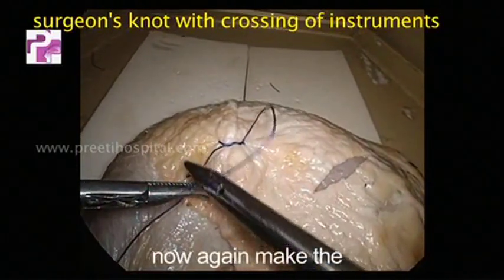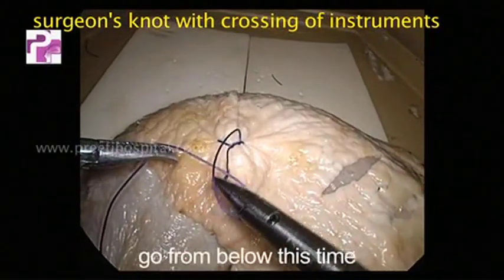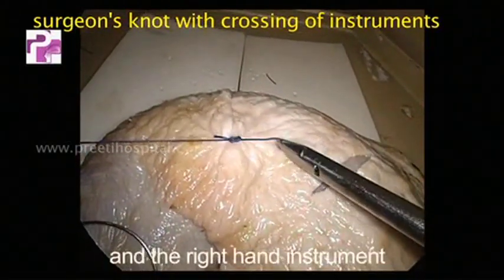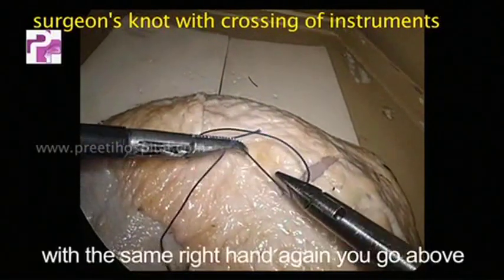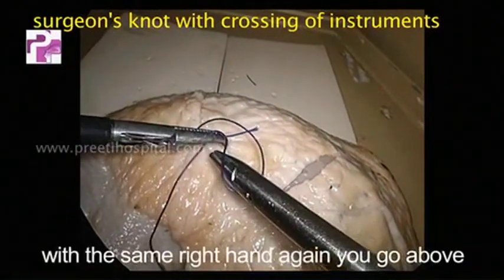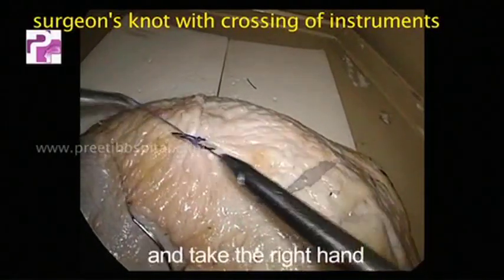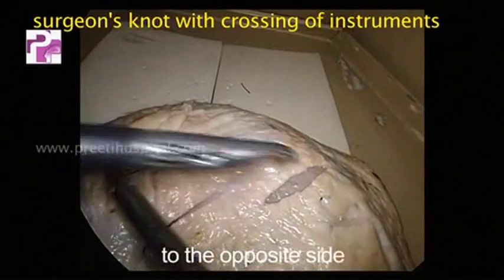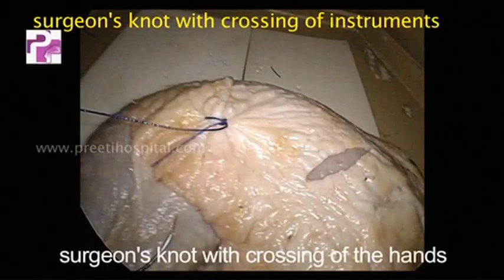Now again make the C or the parallelizing of the thread, going from below this time, and the right hand instrument goes to the opposite side. With the same right hand, again go above, make a loop, hold the tip, and take the right hand to the opposite side. This becomes the surgeon's knot with crossing of the hands.